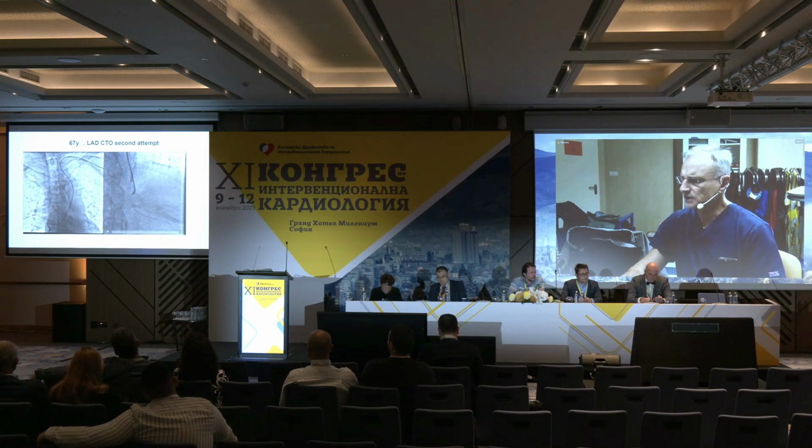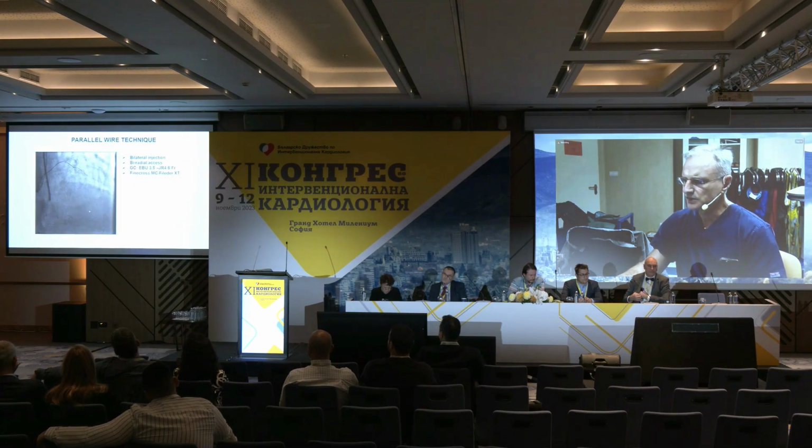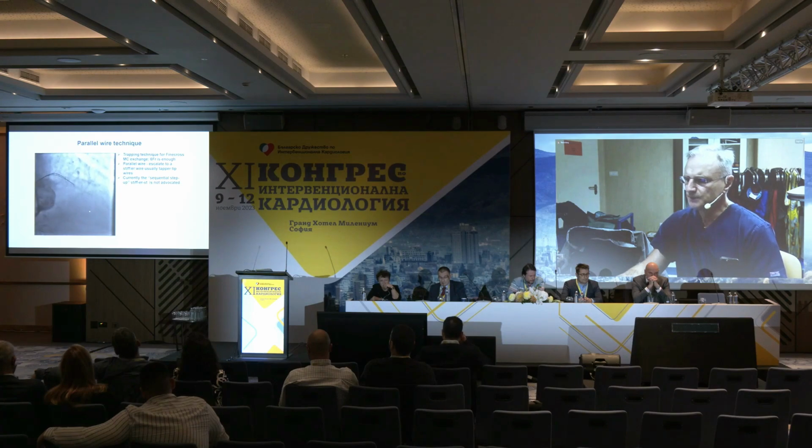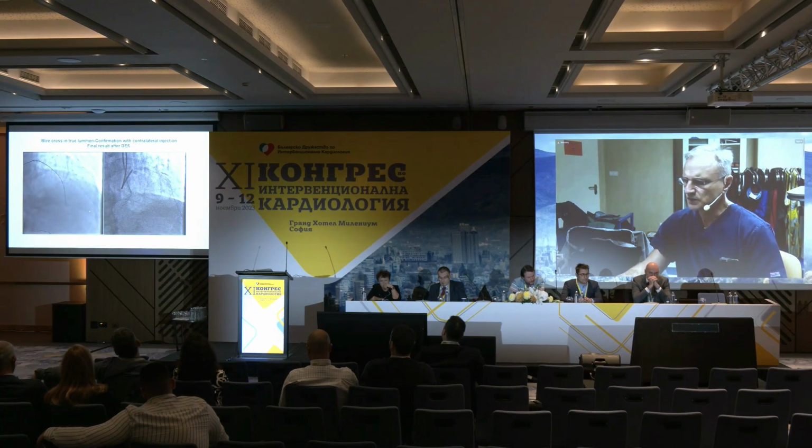What you hear is the classical cornerstone technique that everybody has to have in their armamentarium, the parallel wire technique. You see here an occlusion of the LAD. The double injection is another rule that, especially after the implementation of the retrograde technique, is not to be missed. And you see here that the first wire, which is a Fielder XT, goes slightly subintimal. We don't manipulate too much. Essentially, you just remove the microcatheter, you use it again, you take a stiffer wire. That's the principle. And this small difference is the difference between success and failure.